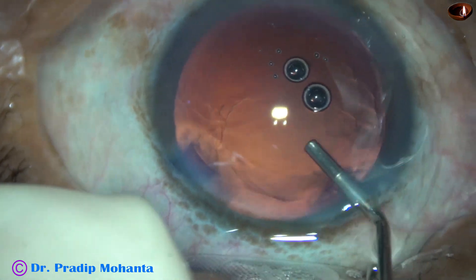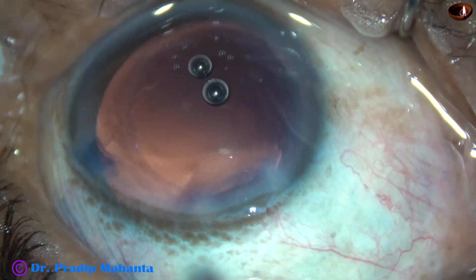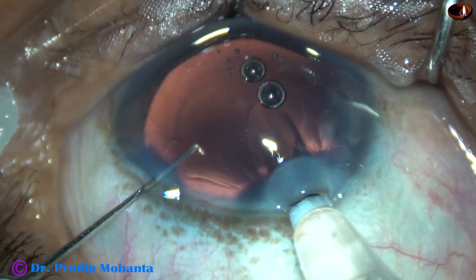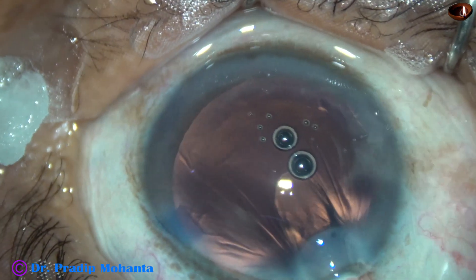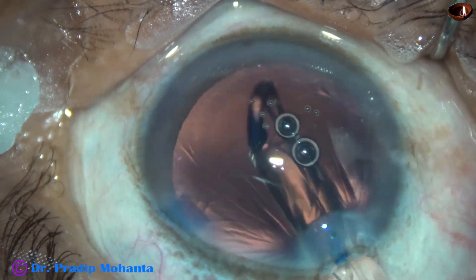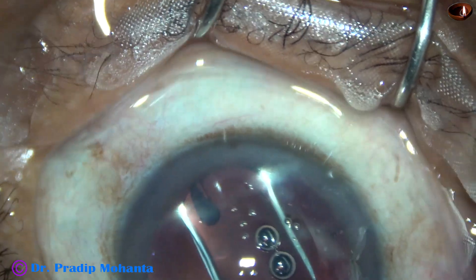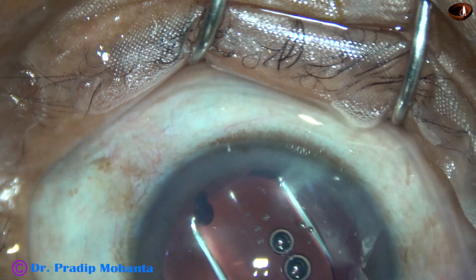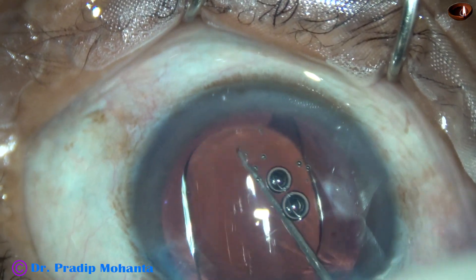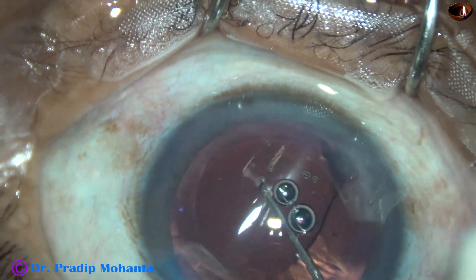We are going to implant a Hoya hydrophobic single-piece monofocal intraocular lens. This is a beautiful pre-loaded system from Hoya, Japan. The tip goes into the anterior chamber and you don't have to enlarge the main wound — it passes through the 2.8 mm wound, and you can very easily deliver the lens into the capsular bag.